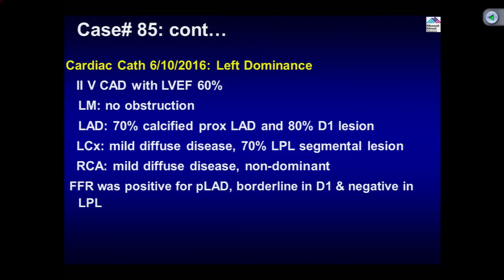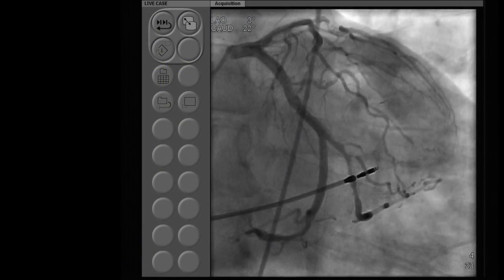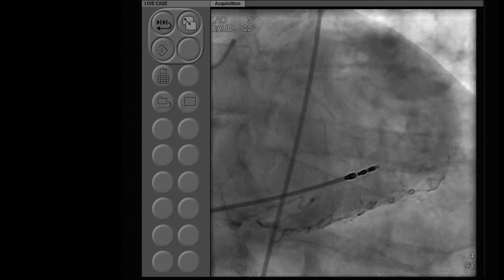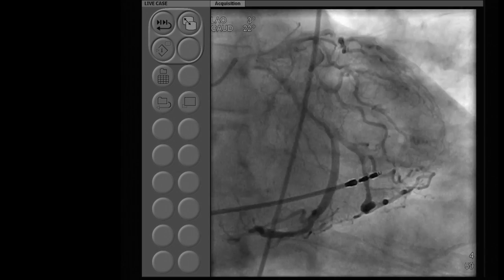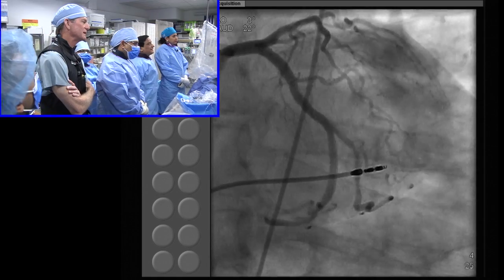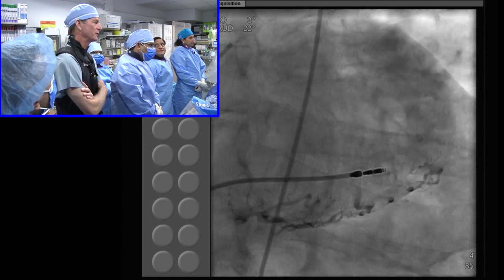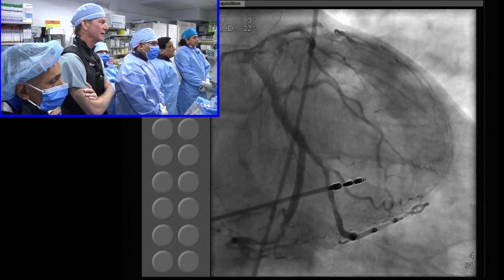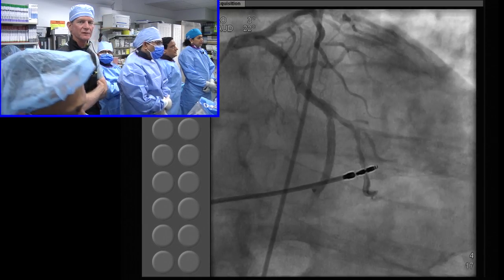Yeah, so if you see the left main is non-obstructive, but just before injection, lot of calcium, especially in the LAD territory. So Chuck, here is the first question for you. Are you concerned with the BVS attempts to be placed in a calcified vessel, or this should be acceptable? Should be acceptable. If it's concentric calcification, I probably would not recommend it at this point. But for eccentric, moderate to severe calcification with a good prep, there's no reason why you can't deliver Absorb.